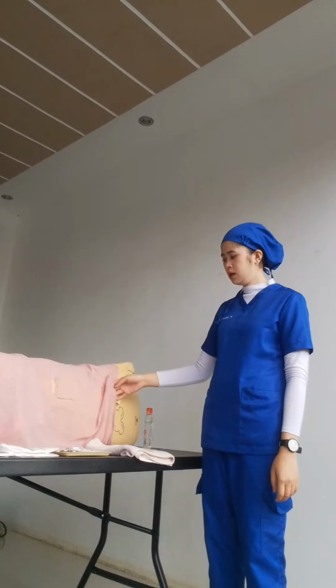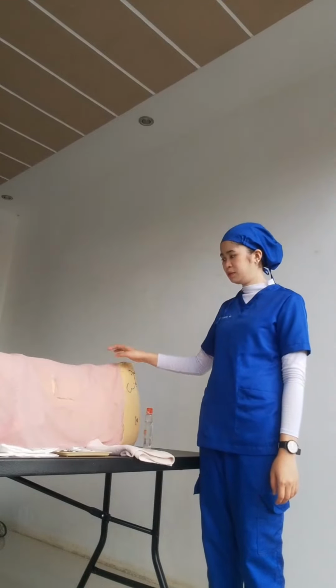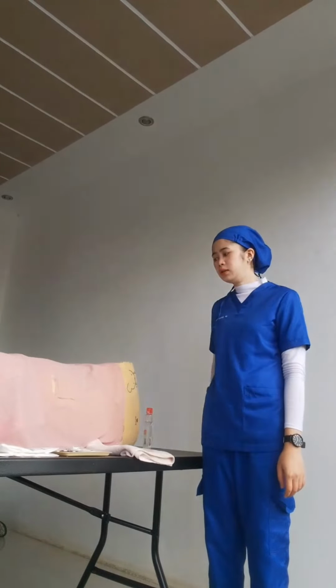The next is the physician cleanses the puncture site with antiseptic solution and drapes the site. As you can see, the drape has already been placed where the puncture site is. Then a specimen of CSF is removed and usually collected in 3 test tubes labeled in order of collection. A pressure reading may be obtained.